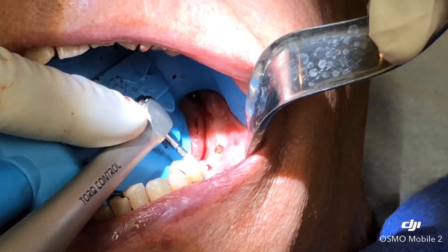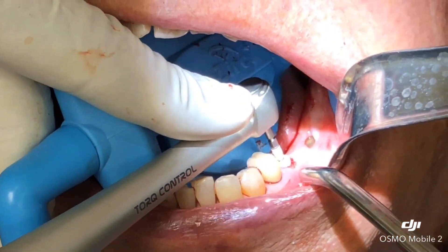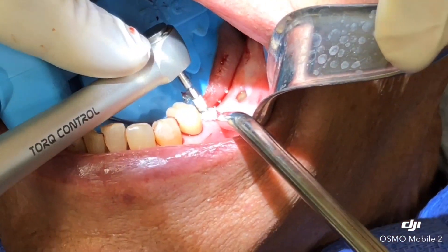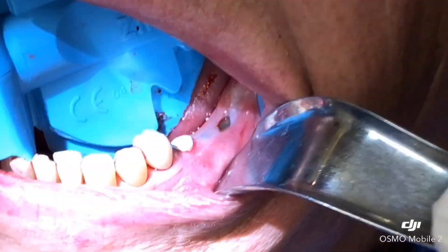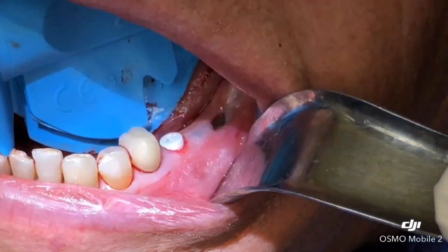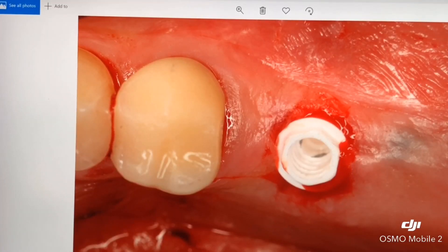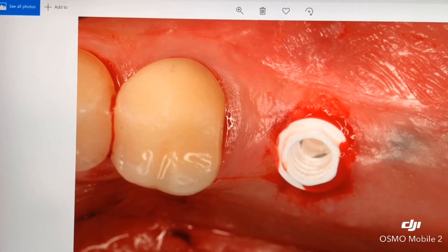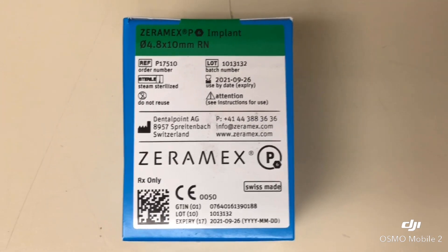This is the healing cap, and the patient will have instructions not to eat on the left side for a few weeks, maybe even a month or two. Here we see the implant right after placement — it is a system that sits right above the bone, between bone and gum level. Xeramex, Swiss manufacturer, full zirconia, metal-free.